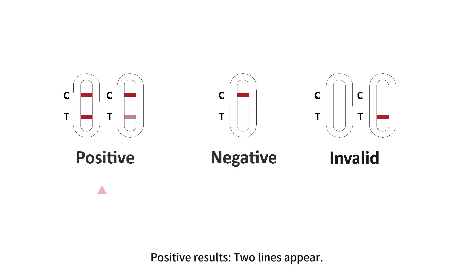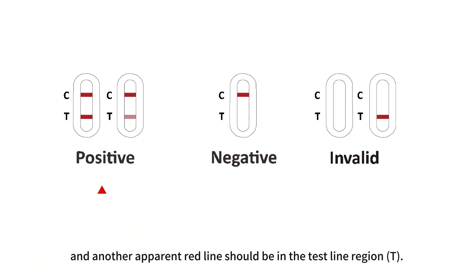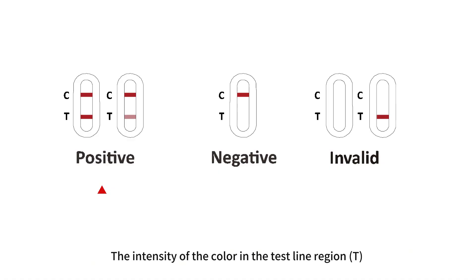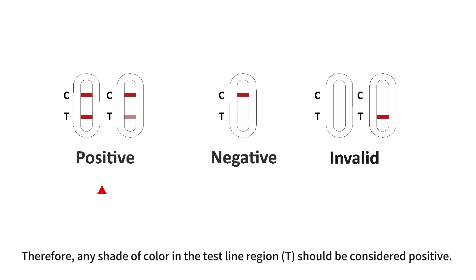Interpretation of results. Positive results: two lines appear. One red line should be in the control line region (C), and another apparent red line should be in the test line region (T). The intensity of the color in the test line region (T) will vary depending on the concentration of H. pylori antigen present in the specimen. Therefore, any shade of color in the test line region (T) should be considered positive.